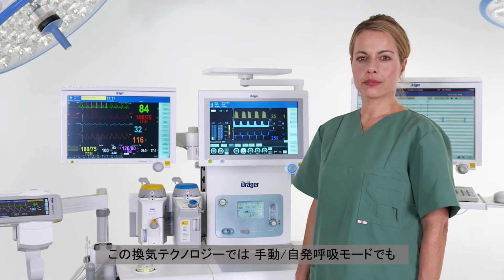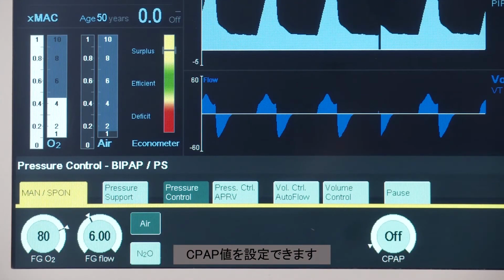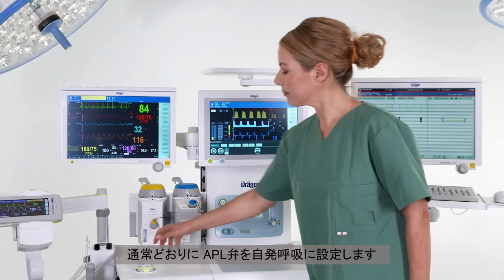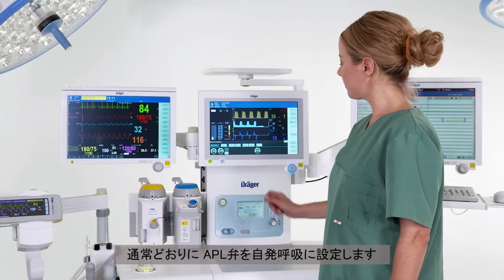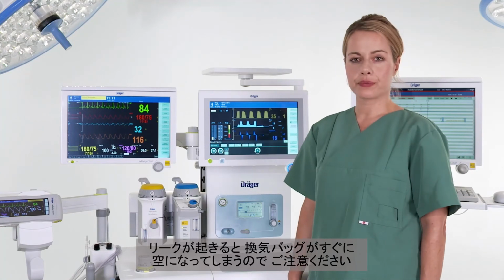The ventilator technology allows you to set a CPAP value even in manual spontaneous breathing mode. As usual, set the APL valve to spontaneous. Please note that any leakage would lead to a rapid emptying of the breathing bag.